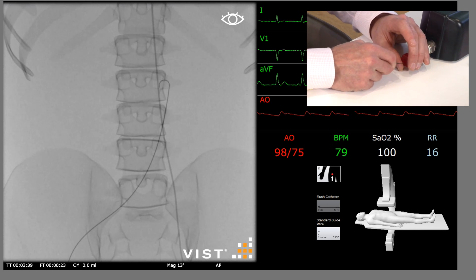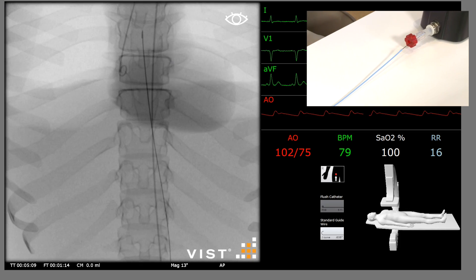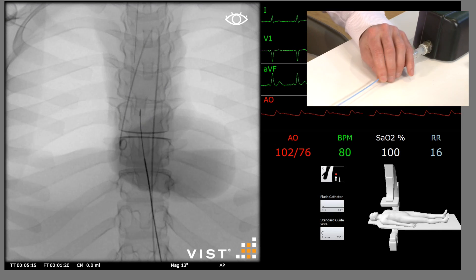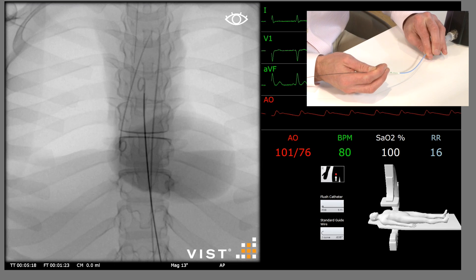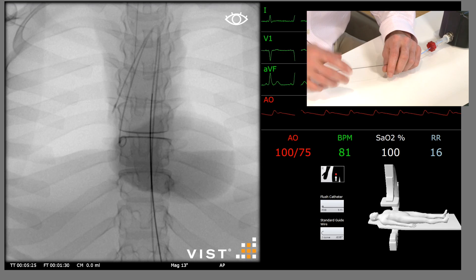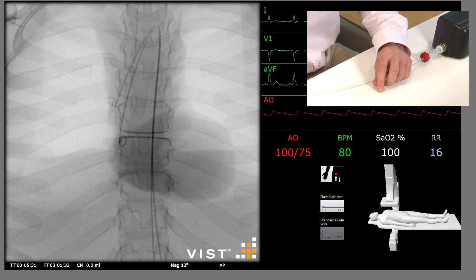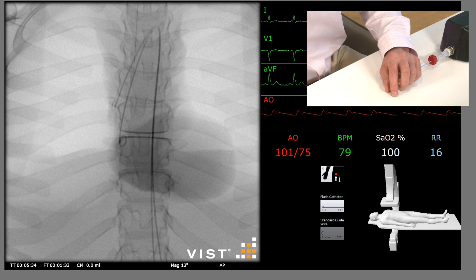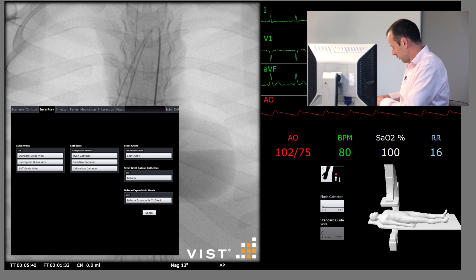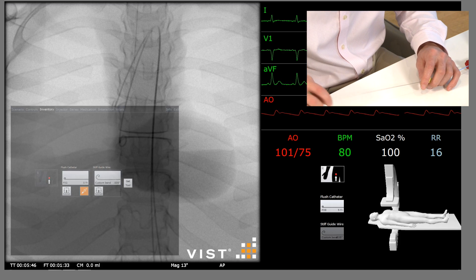We're going to insert a guide wire. We're inserting a standard J-tip guide wire up into the aortic arch followed by a pigtail catheter, and we'll take the two together around the aortic arch. It's a very safe way to cross the arch into the ascending aorta. We need maximum stability for the thoracic stent graft delivery systems — they're very large calibre. So we remove this J-tip guide wire and replace it with a pre-curved Lundqvist stiff guide wire. These are known as coat hanger wires. You need to be very careful with them — you can do an awful lot of damage.